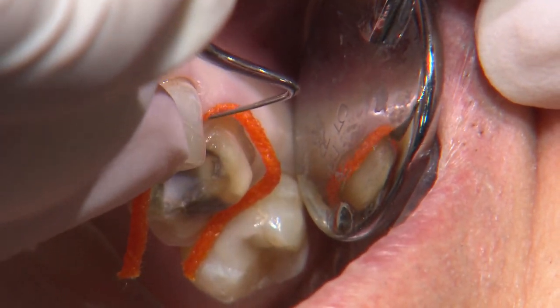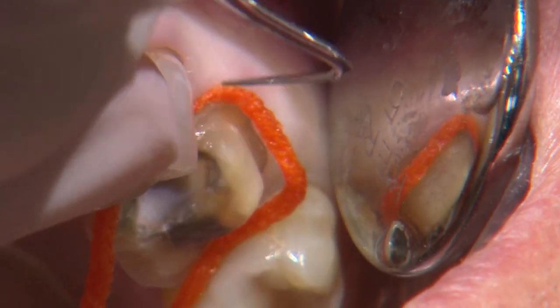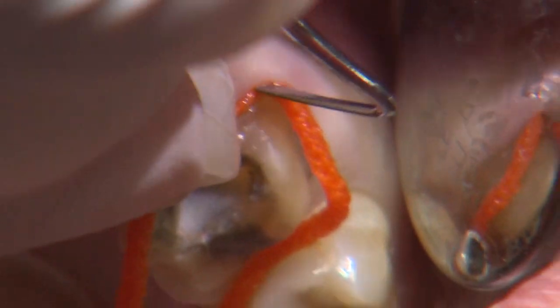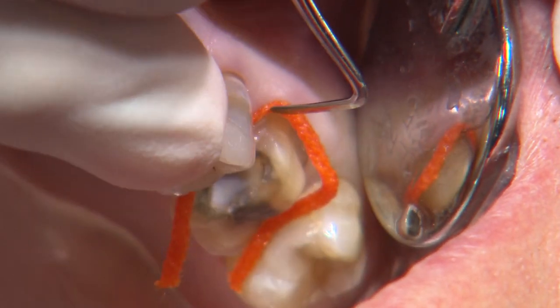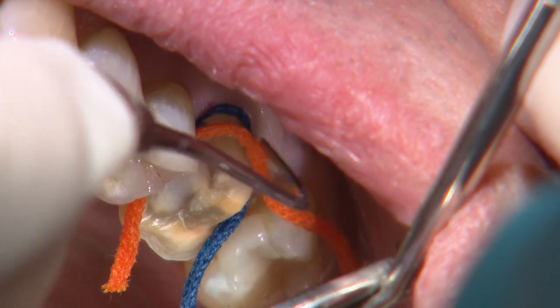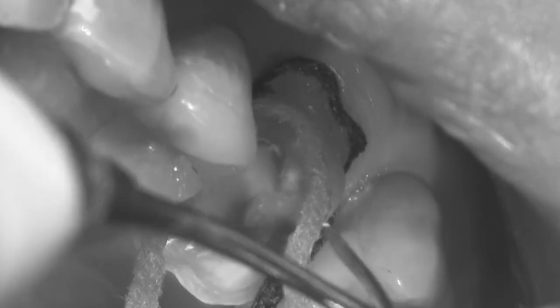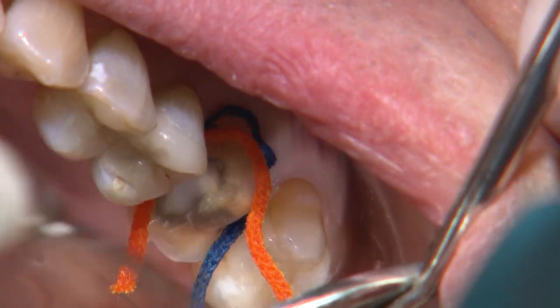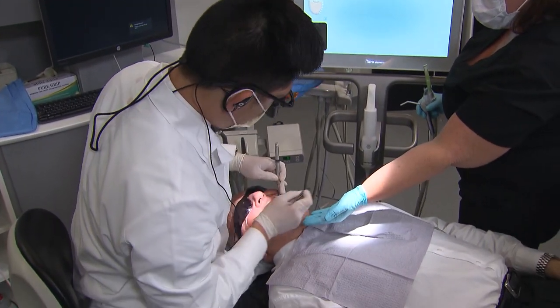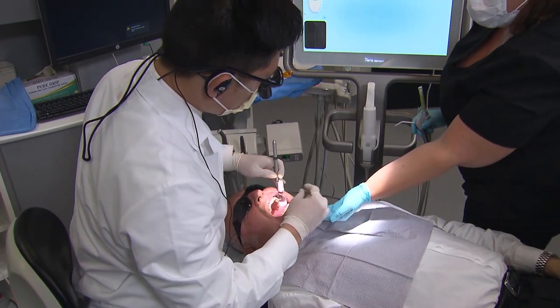If your margins are subgingival, some sort of gingival retraction must be used — otherwise margin identification at best becomes a guesstimate. Here I'm using a single cord technique with a size 1 along the buccal and a size 2 on the mesial. I allow the cords to sit for at least five minutes, then gently pull the cords while they're wet right before I take the digital impression.